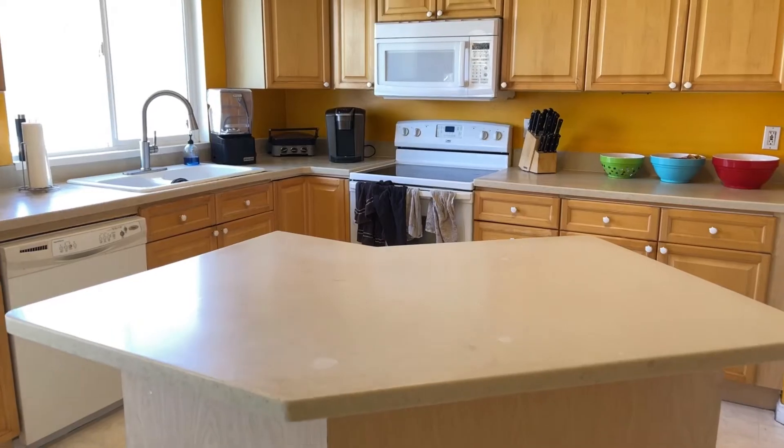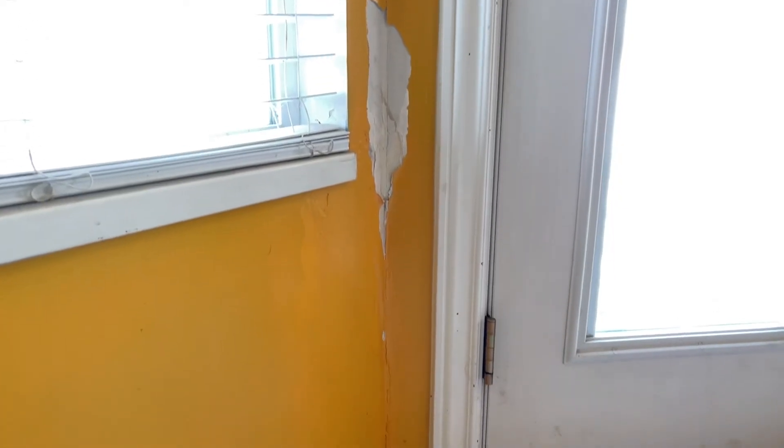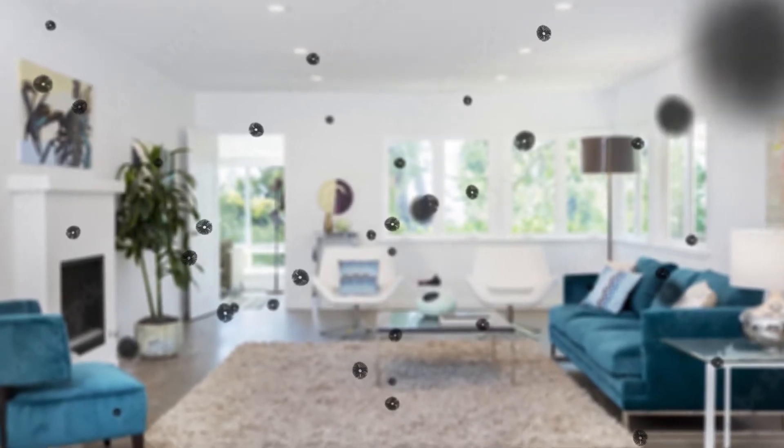Hi, I'm Matt with Sporesight. In this video I'm going to walk you through everything you'll need to perform a professional air sample collection for AI analysis by Sporesight. We use these air samples to assess the types and levels of mold present in the air of the home. Air samples can help identify mold that can adversely affect the indoor air quality. Elevated mold in the indoor air can be an indication of moisture inside the home.